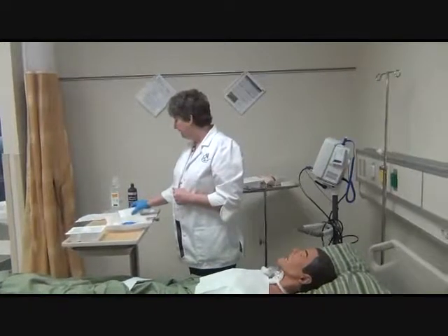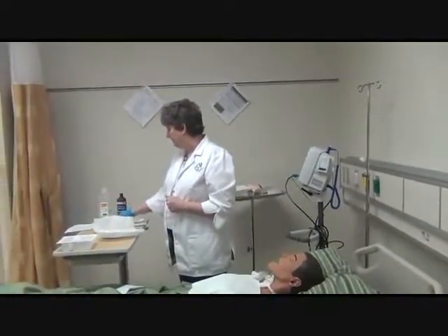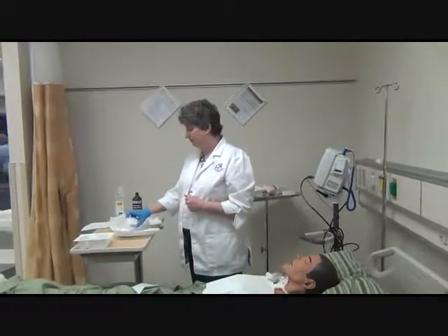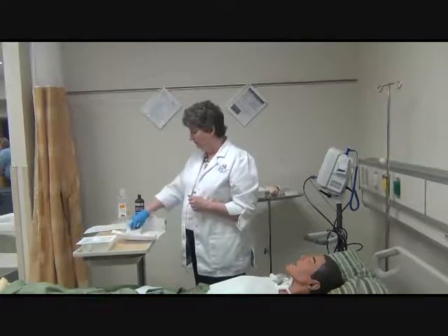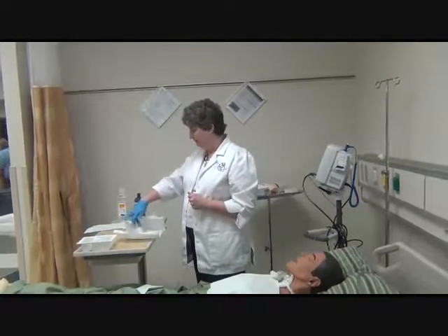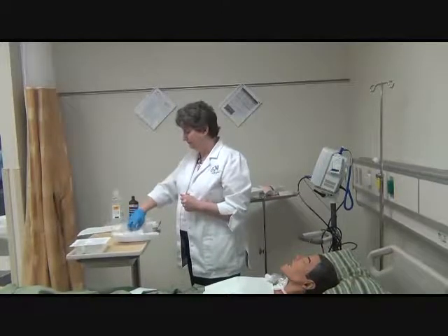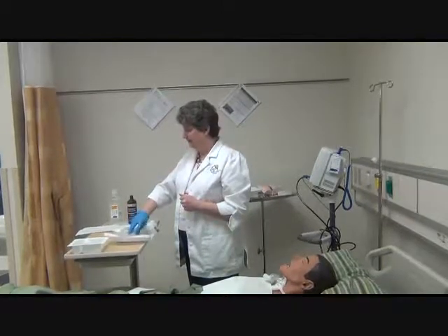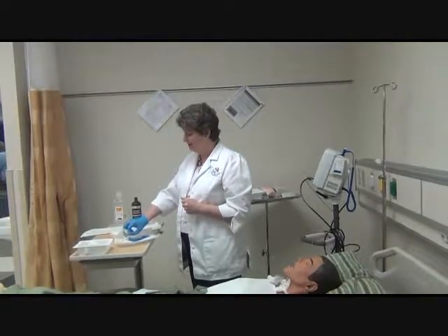So I'm going to go through the suction procedure now. I'm going to take this suction catheter and lay it here while I get my little irrigation bowl. Both are sterile, and because this kit's been used, this is not working as easy as it should, of course.